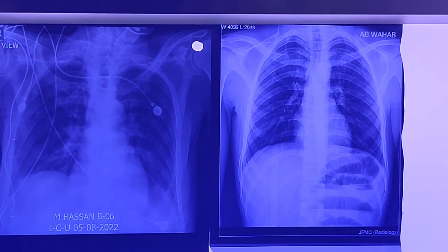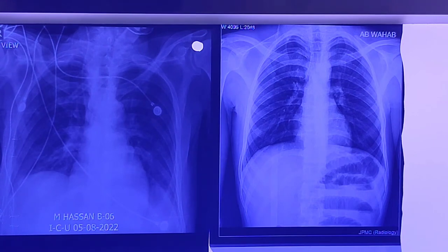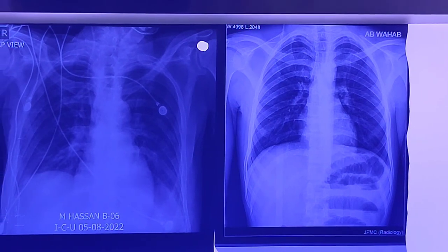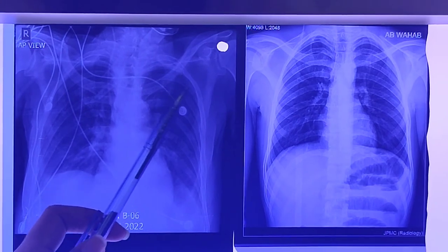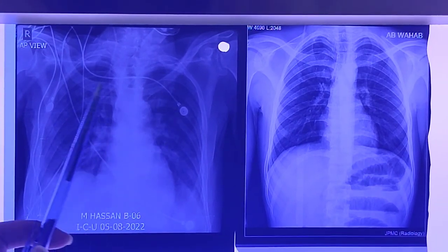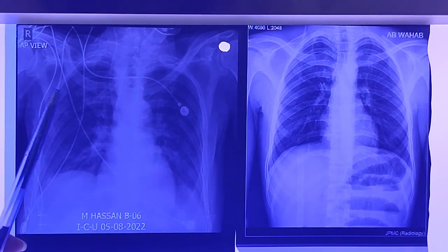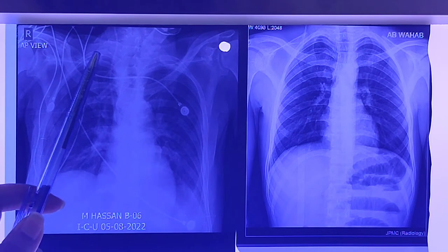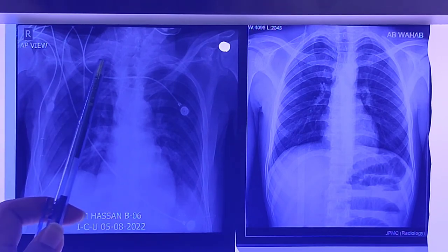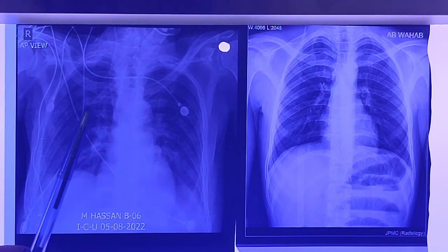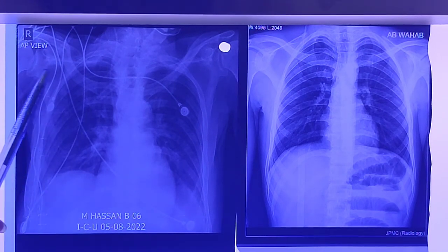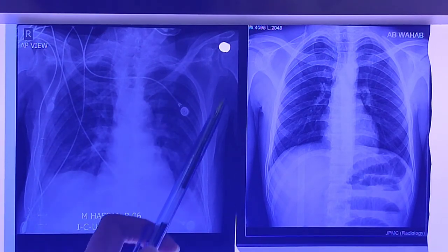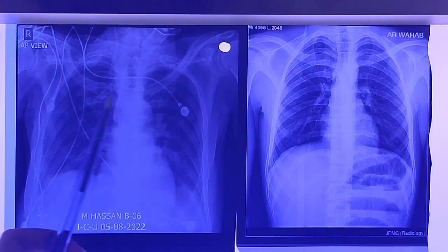The second differentiating point here is the scapula. In the AP view you can see that the scapula on both sides are overlapping the fields of the lung. Here you can see the margins of the scapula on both sides.